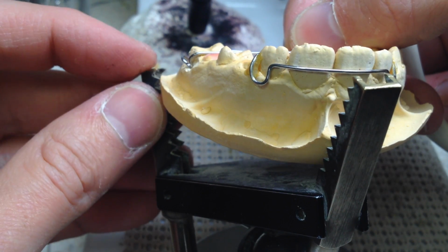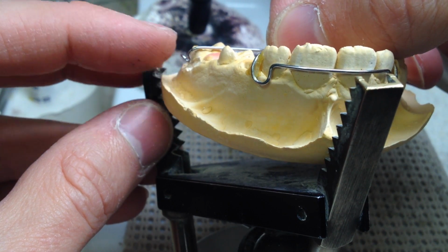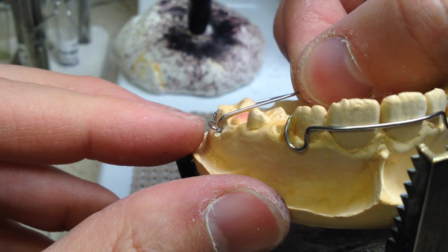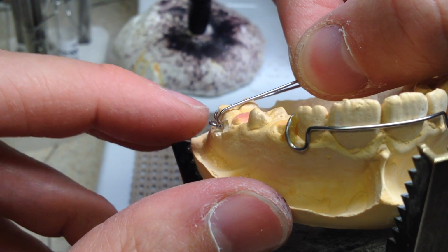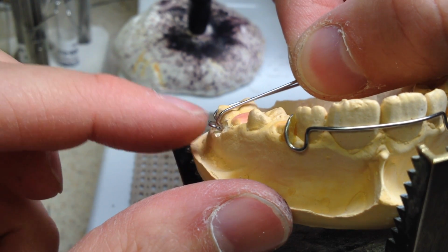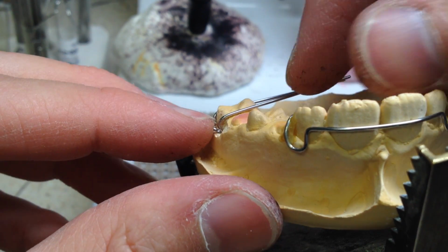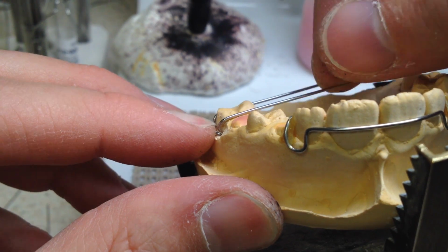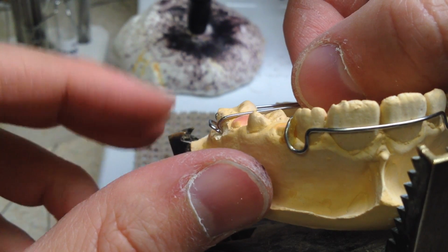See how that's almost perpendicular. So if I want to, let's say, raise this bridge or increase the angle of it, see how if I want it more perpendicular, I would make this bend right here more. Maybe you can see if I do like this. So there you go.